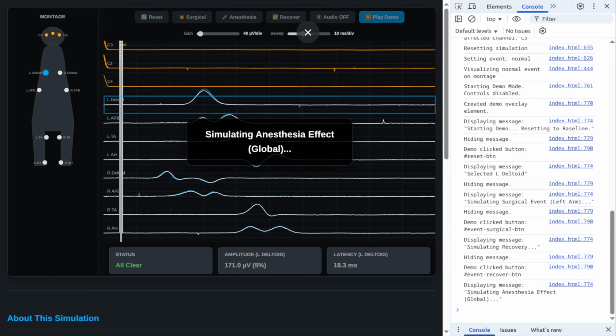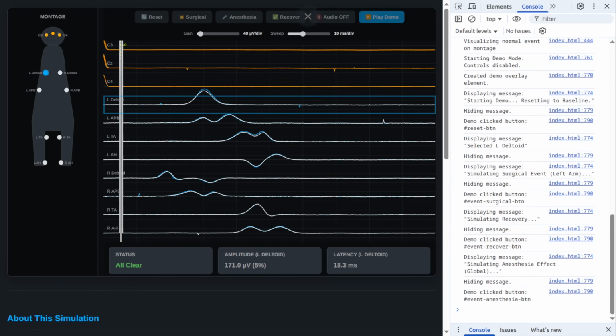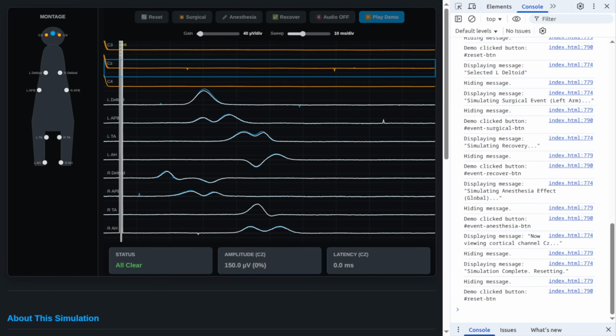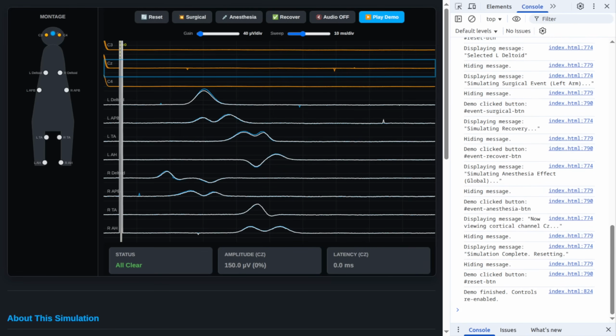And a core part of that involves looking at motor evoked potentials, or MEPs, and also cortical sensory responses. These signals give the surgical team instant feedback. It lets them adjust, maybe prevent complications before they become permanent. It's all about being proactive, not reactive.